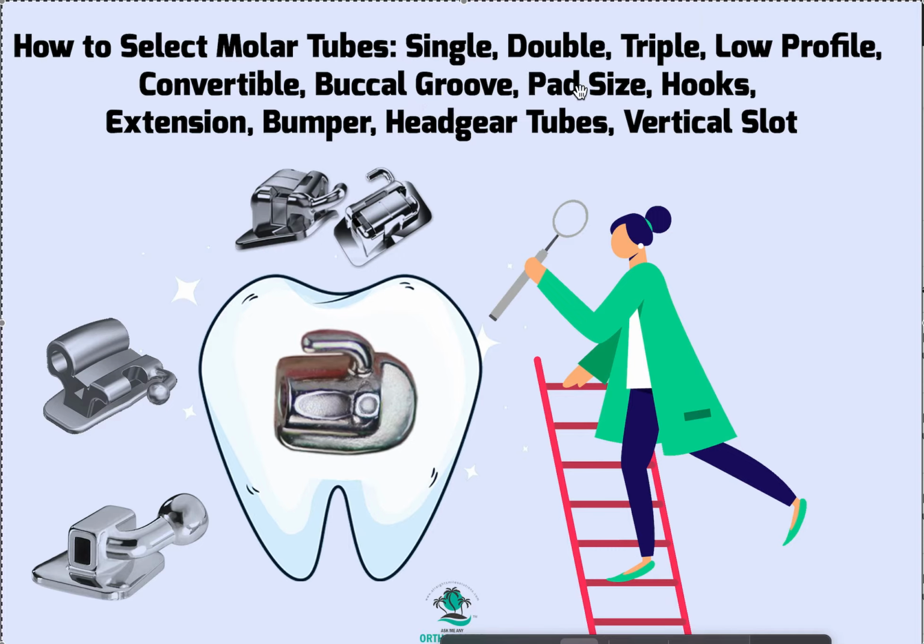Pad size is a big deal. Obviously you want as big a pad size as possible, because the bigger the pad, the less likely it's going to break. Obviously the back of the pad should already have the mesh. Sometimes they'll have bigger pad sizes and smaller pad sizes, but pick the big ones. The only time a big pad size isn't good is, for example, when you have an impacted second molar that's barely exposed and you have almost no tooth structure. Then you'd want a small pad size, but that would probably be on a 12-year-old molar.